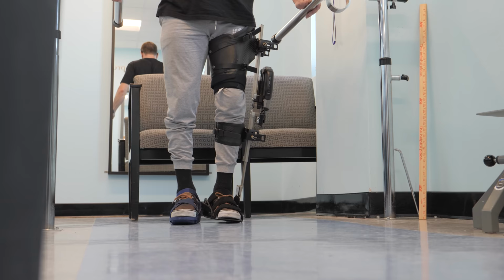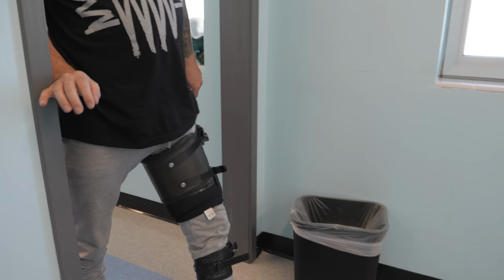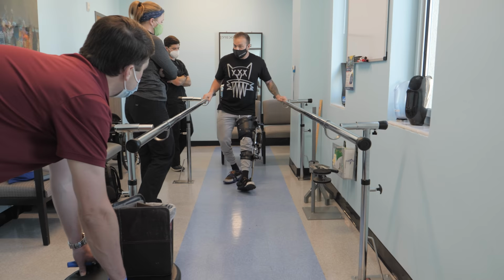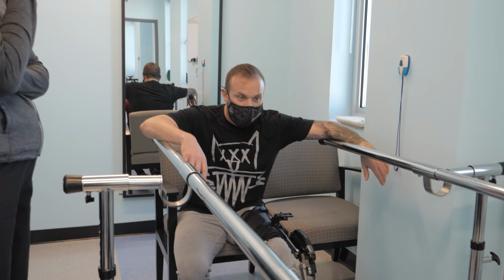To be honest, not that I would lie to you, if you learn to use it, you could decrease the resistances. And I imagine someone like you, it's going to slowly change over time. The knee pain that I normally get from the hyperextension isn't there. That's good. However, new acquired shin pain. Every time I step, it's on. So, I think Gary was about to say that you overwhelmingly passed. We can probably let him run if you want to keep messing with it. You got any more questions for Drew?